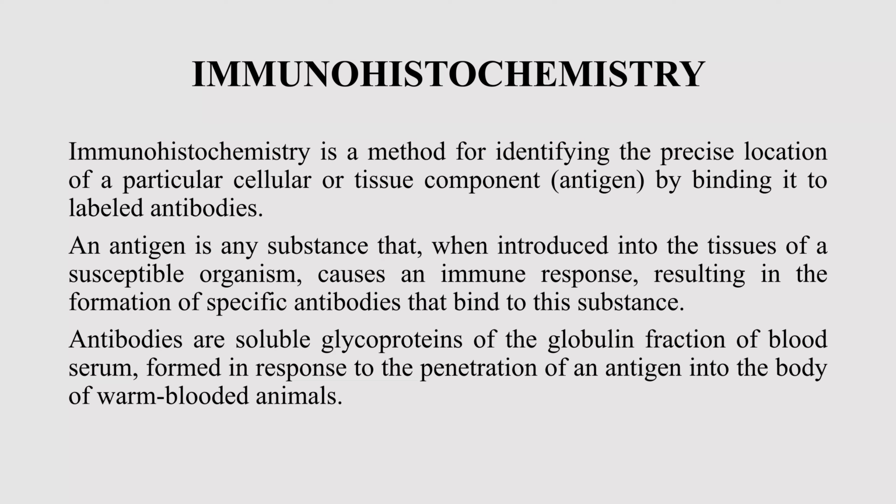The first application of this technology was the direct method, where the antibody and antigen are linked with fluorescein or some tag which makes the reaction visible. But later, and nowadays, we use indirect methods which use an additional antibody, primary and secondary.